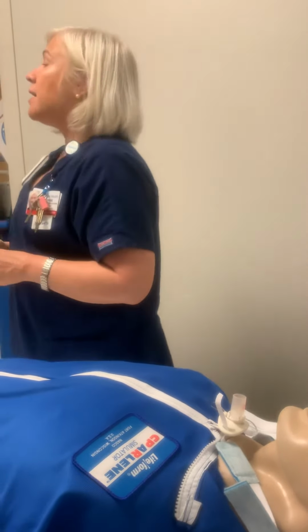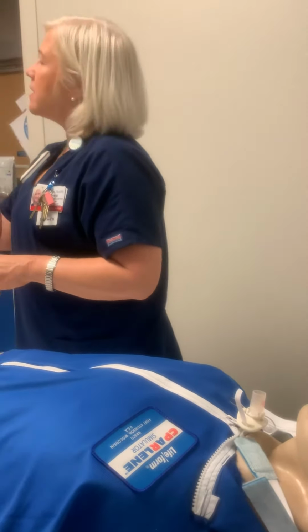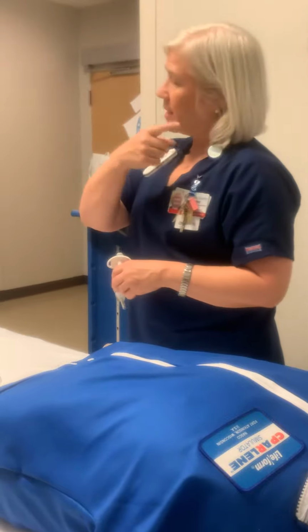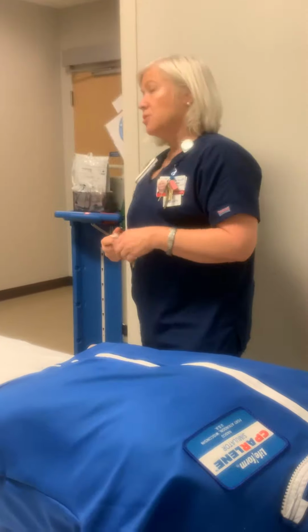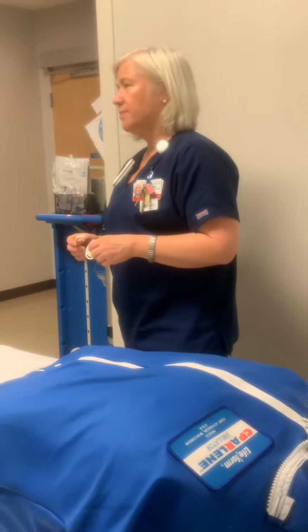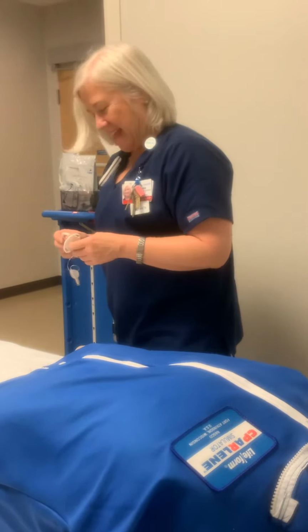Fortunately, it doesn't come up often. By the time they make it to you over here, they're days post-op anyway, so it's usually not a problem. It's only more of a concern when it's a fresh one, and usually they're sutured in. I remember as an inpatient nurse, that was always taped to the head of the bed. But our people are obviously not in that situation anymore.